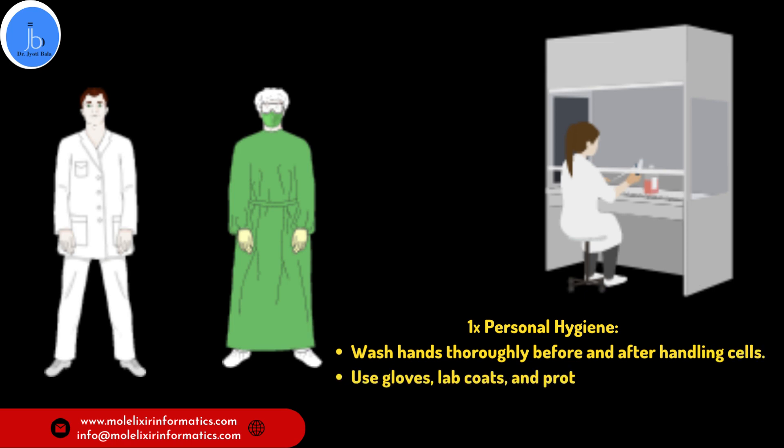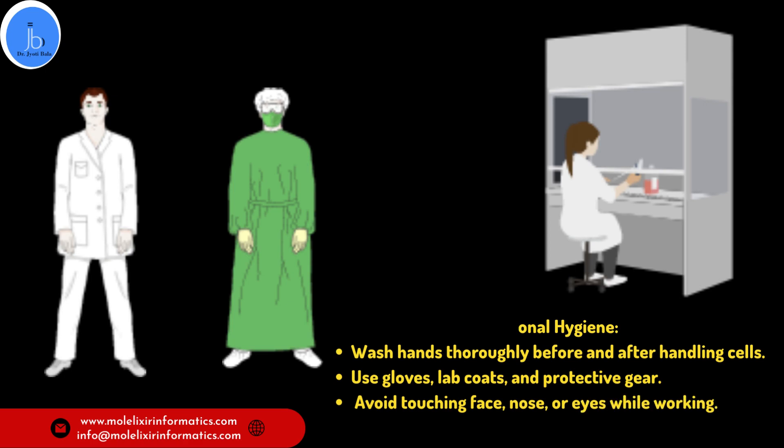And remember, avoid touching your face, nose, and eyes while working to prevent any potential transfer of contaminants, especially if you are working in a virology lab.